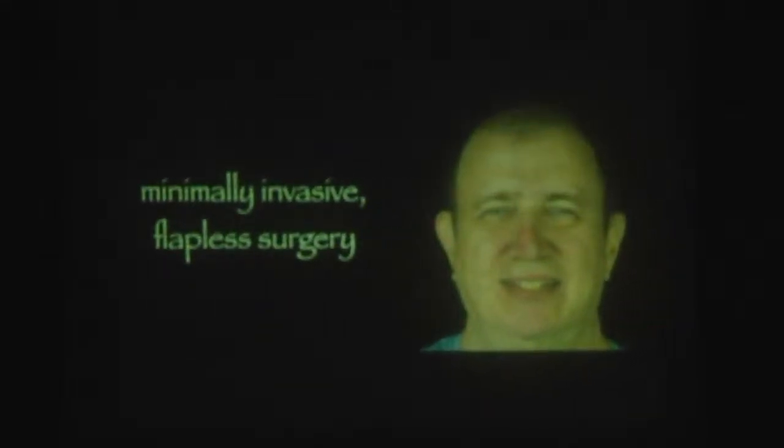It's quite good. So, minimally invasive flapless surgery. I mean, we have some sinus pneumatization and we want to avoid the bigger surgeries. Then we want to do a simple case, and the patient came to my clinic with this. Doctor, I have a prosthesis. I don't want to change it because I don't have so much money, but I want you to fix my prosthesis in my mouth. Normally, it's not so easy, but let's show what I did in this case.